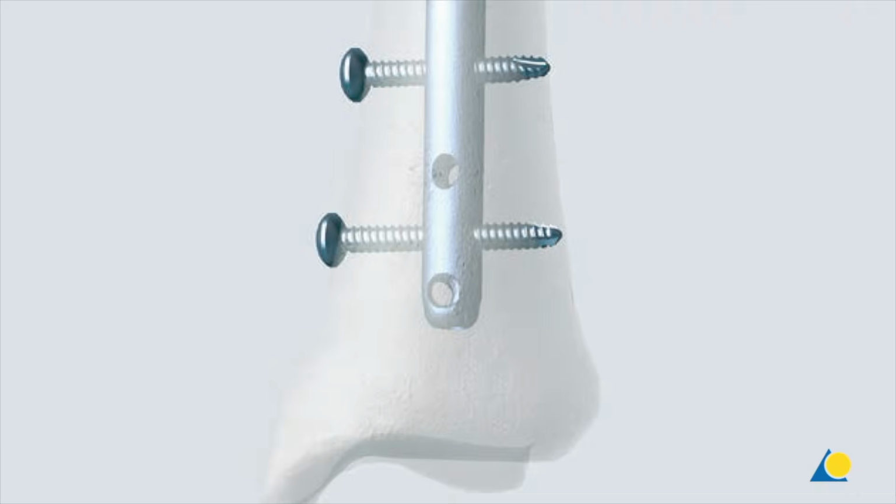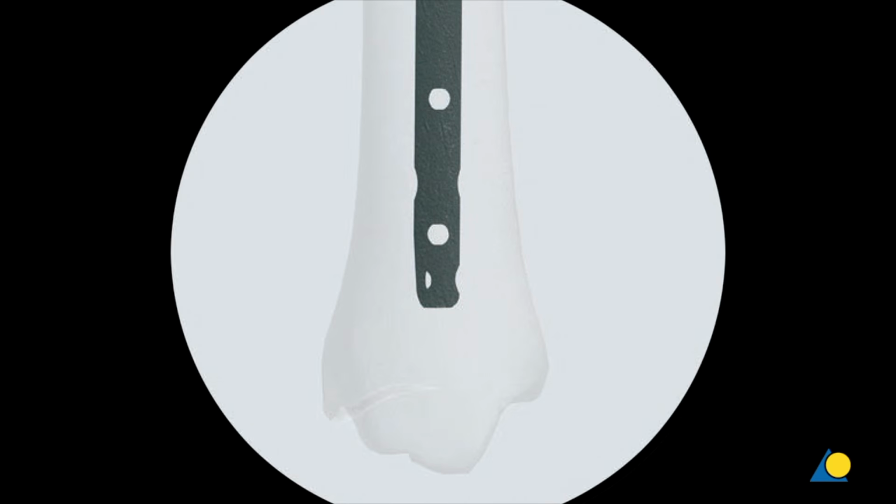Locking of the tibial nail is usually performed from the medial side, if possible, with the leg extended. This position helps counteract the forces exerted by the quadriceps muscle that would tend to deform the proximal fragment and also facilitates rotational control of the tibial axis before locking. The position of the nail is verified under image intensification. The reduction, correct alignment of the fragments and leg length must be confirmed before locking the nail.